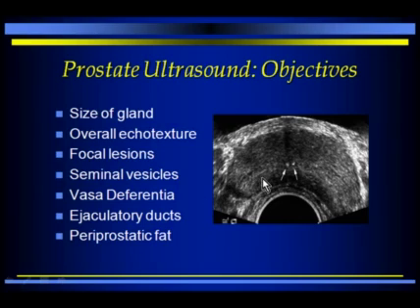Now in this patient, we actually see two very nice little echogenic foci here on either side of midline. This is some secretions inside the ejaculatory ducts of a patient who's being evaluated for infertility and has his ejaculatory ducts plugged up with these concretions.